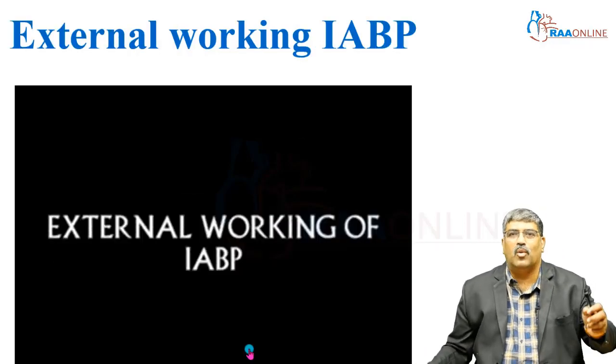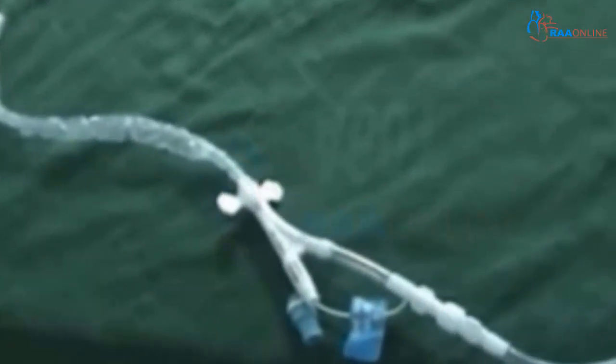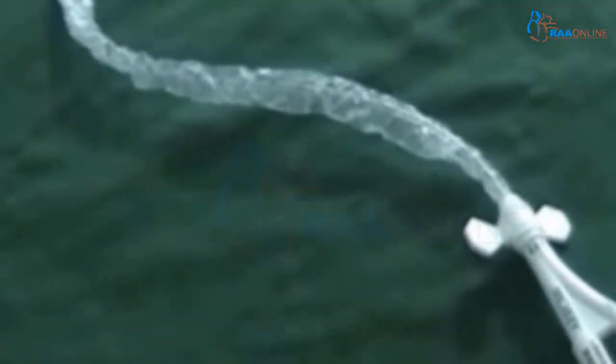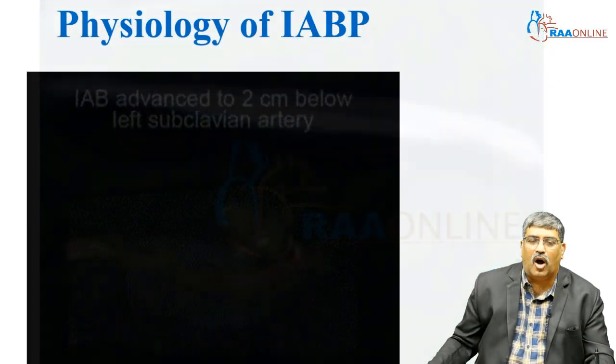Now coming to the working of the intra-aortic balloon pump. Here the balloon is connected to the gas source, which is helium. This is the gas source through which the gas comes inside the balloon. The balloon inflates and deflates. This is how it works. It inflates and deflates. So how does it help?